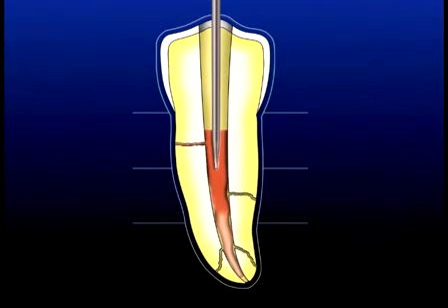The probe of the touch and heat unit is introduced into the orifice, activated, and allowed to plunge 3 to 4 millimeters into the coronal mass of gutta percha. The heat activating element is then released, and the clinician pauses just momentarily, allowing the instrument tip to begin cooling, then removes the instrument along with an adhered bite of gutta percha. 2 important events have occurred.